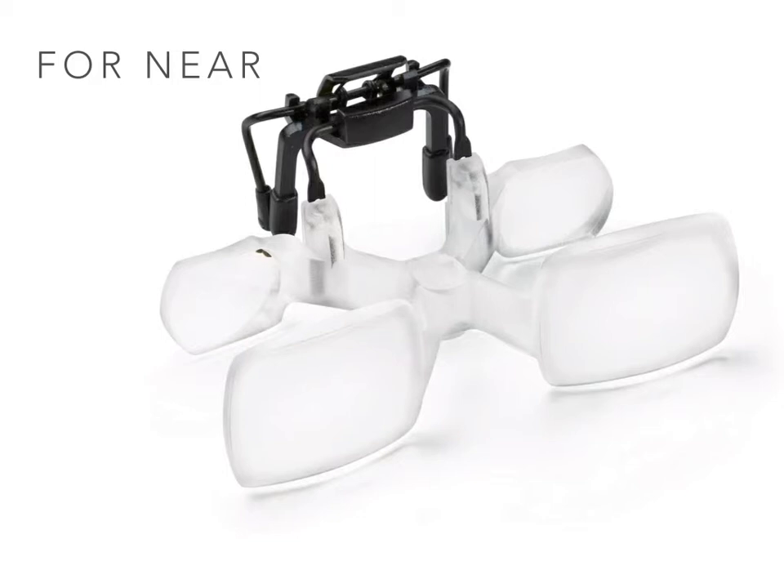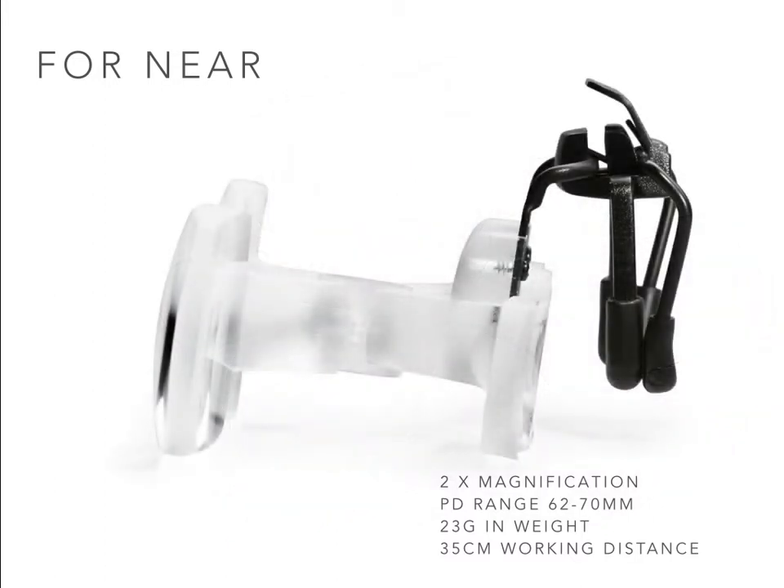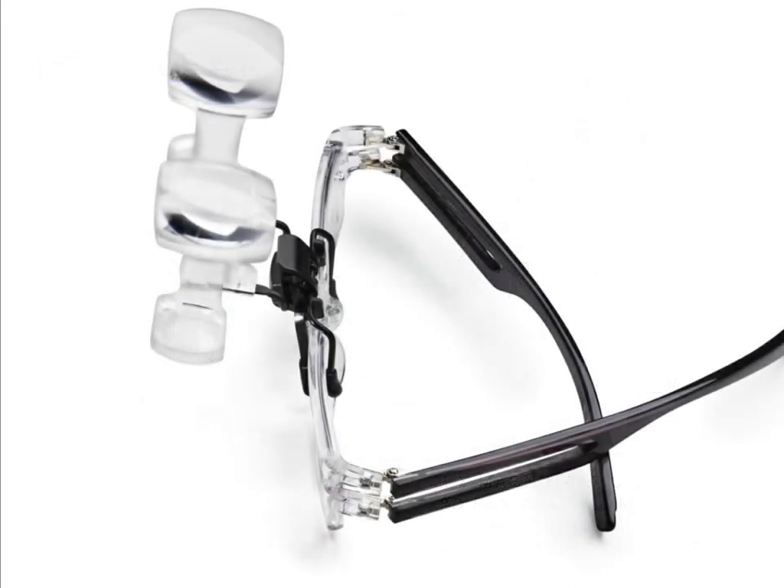This telescopic system, called the Max Detail clip, is half the weight of the previous Max Detail stand-alone magnifier, adding only an additional 23 grams to the user's current spectacles. The system will clip onto the majority of spectacle frames. The height is also fully adjustable so that the centres of each telescope lens can be positioned to coincide with those of the user's own spectacle lenses, achieving maximum field of view and visual comfort. When not in use, the mounting is hinged so that the telescope may be flipped up and out of view.